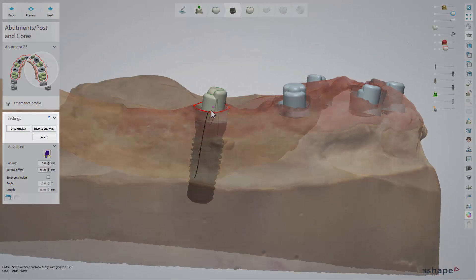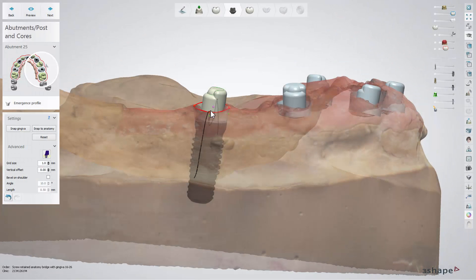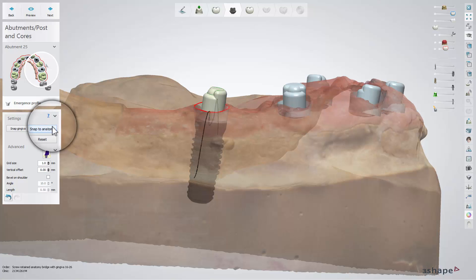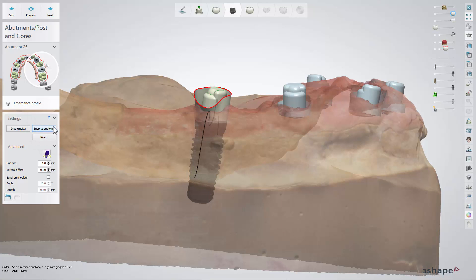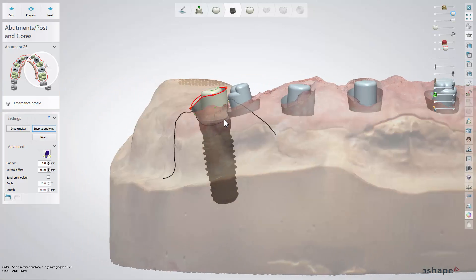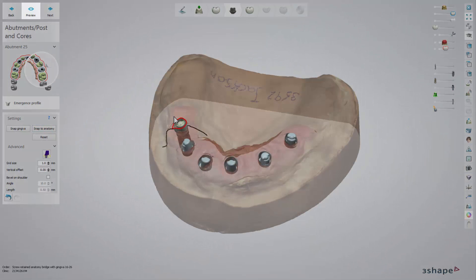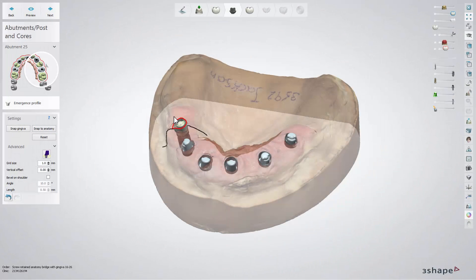When you have it at the required level and your emergence profile has been formed by a healing cap, click the Snap Gingiva button. This will fit the emergence profile completely. However, if you do not have a nicely shaped emergence profile, use the Snap to Anatomy button to automatically snap the profile to the earlier designed crown. Clicking preview will allow you to see the crown's connection to the emergence profile. After finishing the emergence profile design, click next to go to the Anatomy design step.